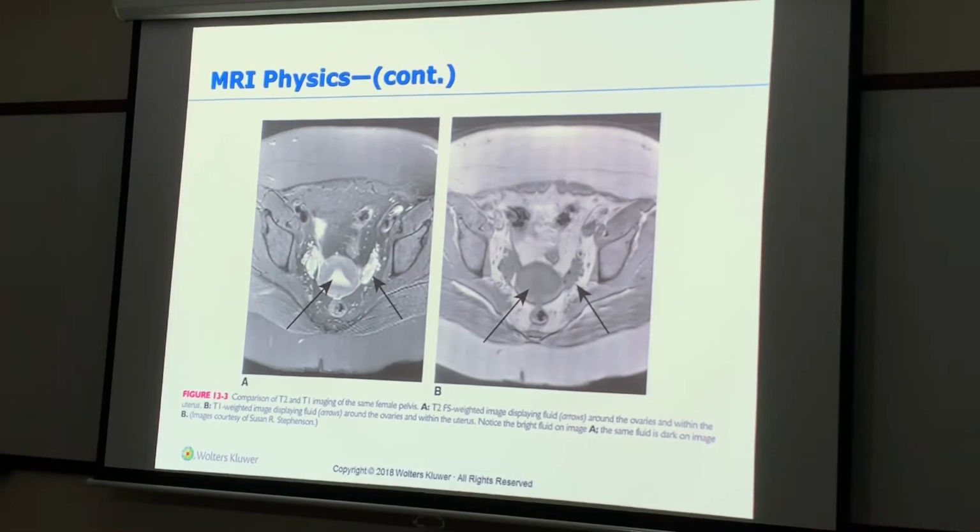I'm going to choose T2, because look how fat looks here, and look how fat looks there. And if I'm wanting to find something, because I've got something just underneath the skin, I'm going to choose a T2. It's just my technique that I'm going to use. Just like we have harmonics, and we have a change of transducers, yours is a button.